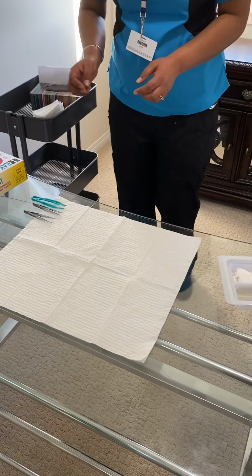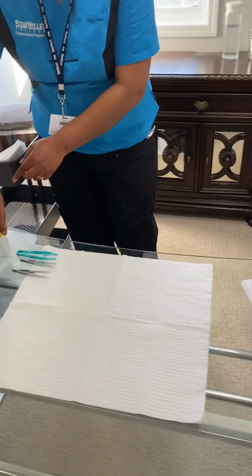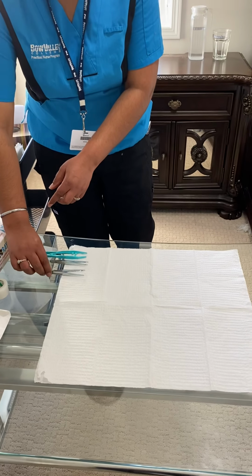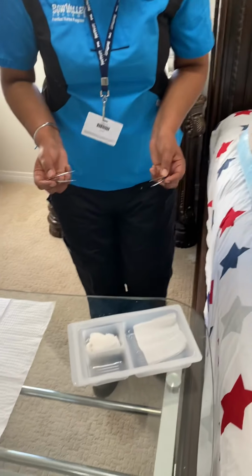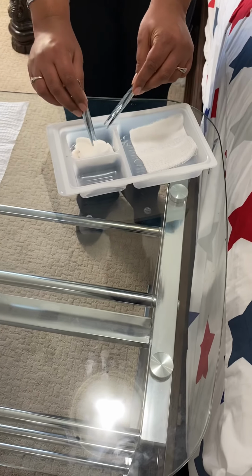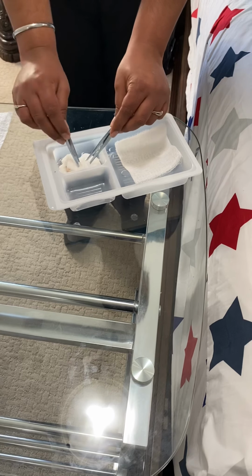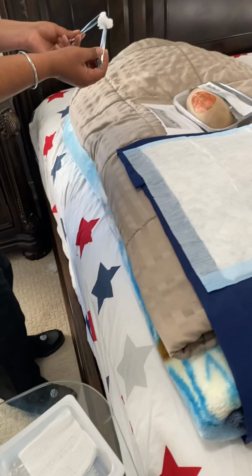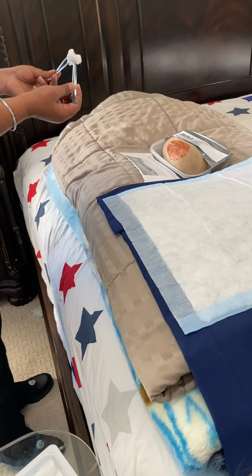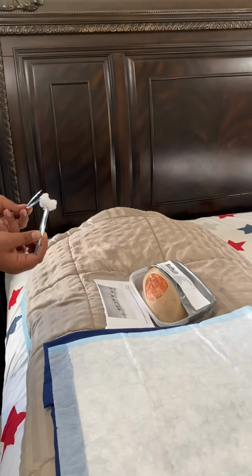Now I take my two forceps to pick the 2x2 gauze to clean the wound. The first one and the second one. I'm avoiding cross contamination. Now I'm making the pillow of 2x2 gauze, and now I'm going to clean the wound. So I'm going to clean from clean to dirty, that is from top to bottom.